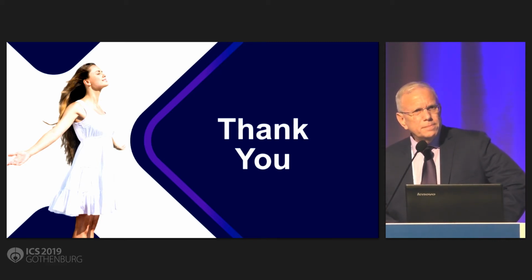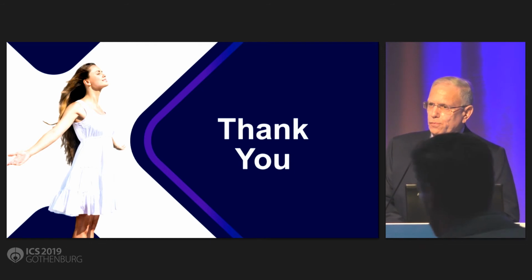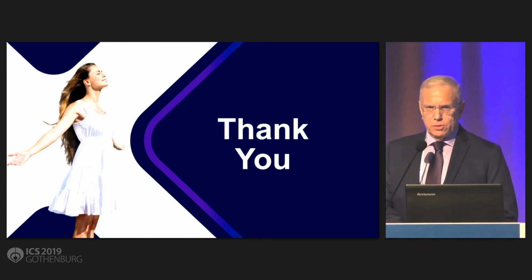Please. Delia, from the Netherlands. A typical Dutch question: how long can one use one device, and what does it cost compared to the normal pessaries? Okay, good. The device was actually designed to be used for up to 7 days. When I say up to 7 days, it means a woman can insert the device in the morning and decide that she wants to have intercourse in the evening, take it out. This is up to her. One of the things about such devices is that this moves the control into the hands of the woman. As I said, she's allowed to use the device for up to 7 days, but the real length is up to her. As for the costs, and I'm talking mainly about the United States, the cost will be comparable to what happens in the United States when we talk about payments to the doctors and payments for the device itself. Altogether, it's about $3.50 per device.